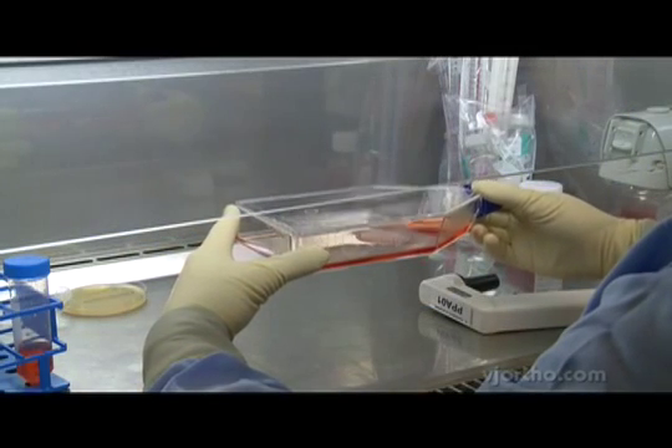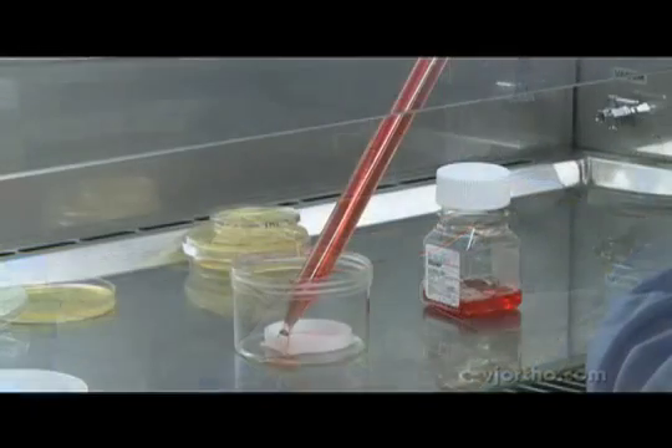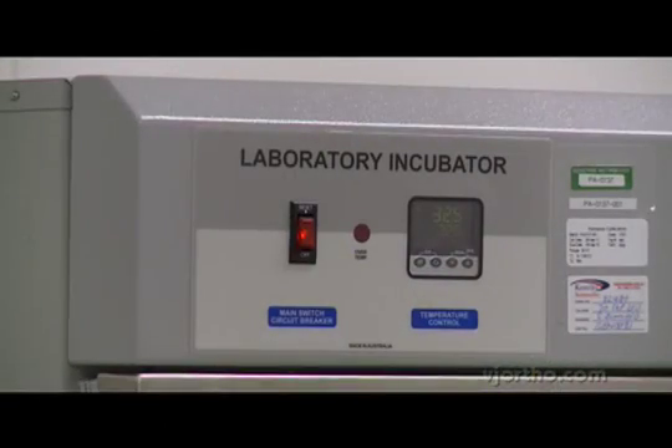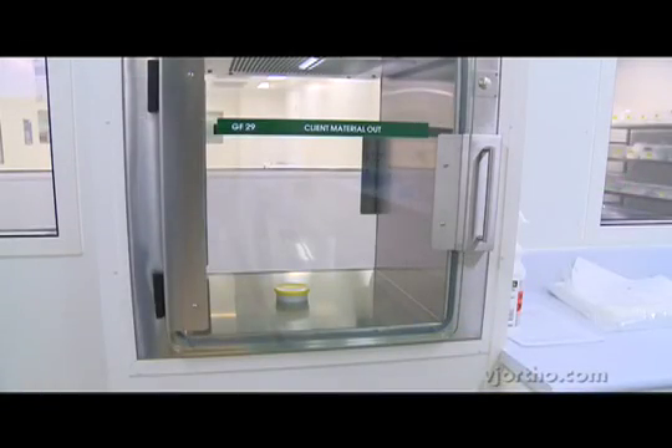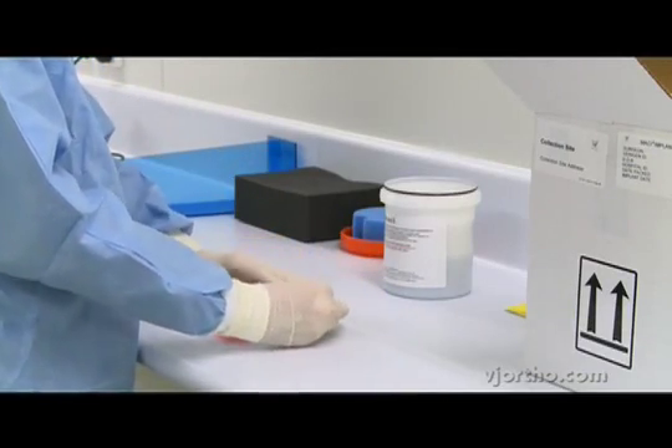The chondrocytes are then seeded into a tissue flask with a culture medium. There's an expansion period, after which the cells are seeded onto the porcine membrane, generally about three days before the planned implantation.